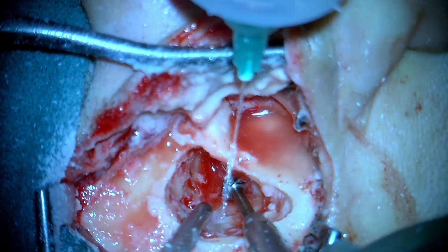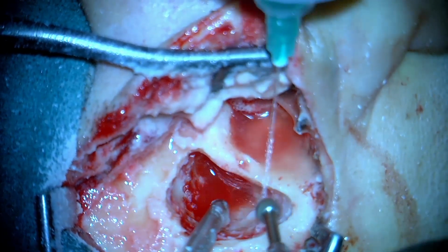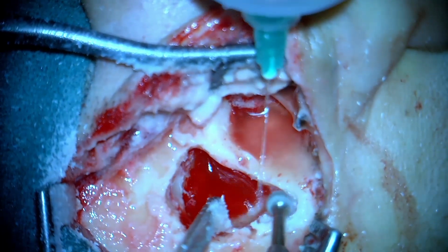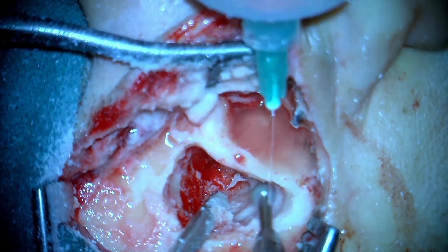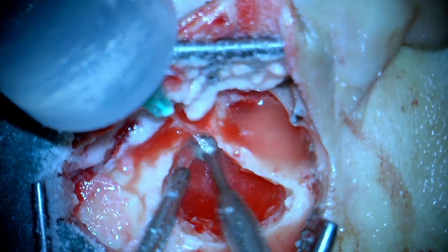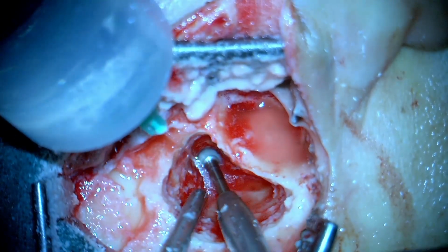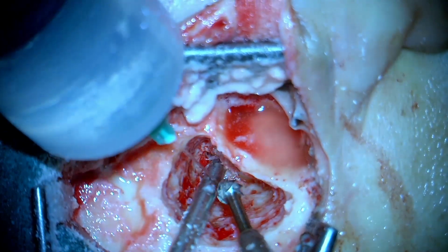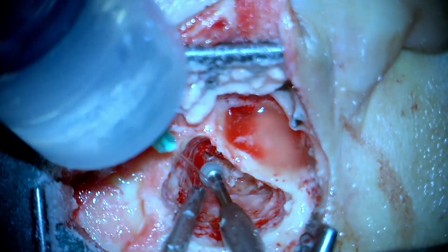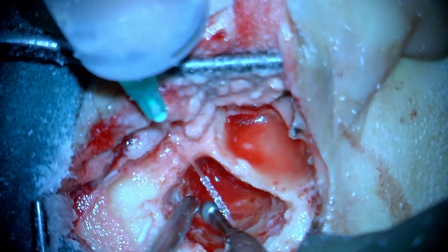You mostly notice that we're not seeing any cholesteatoma per se inside the mastoid antrum and the mastoid cavity. We can just see overall edematous and inflamed mucosa that is quite hyperemic and bleeds on contact. For the most part, that's a good thing, that we have not found any gross cholesteatoma inside the mastoid proper. Now, the endpoint of this would be exposing the posterior epitympanum, that is mostly just seeing the short process of the incus and seeing if everything behind that is clean.